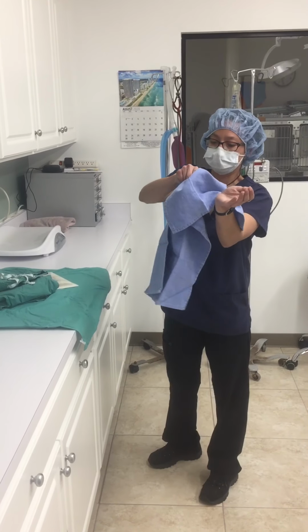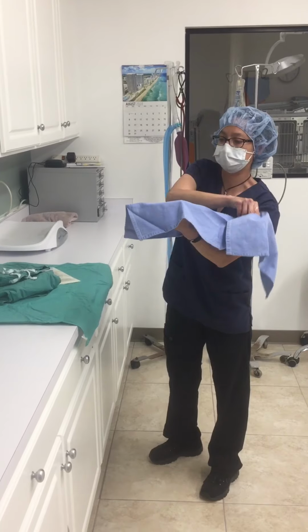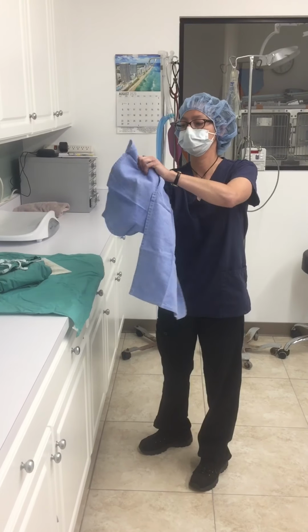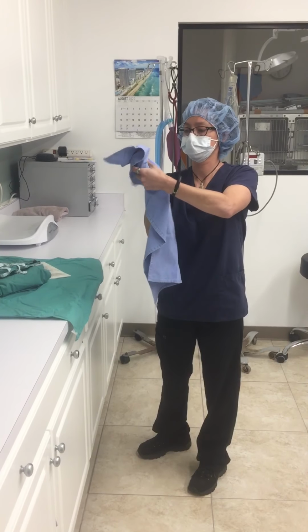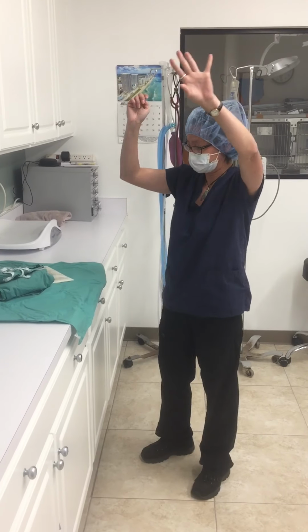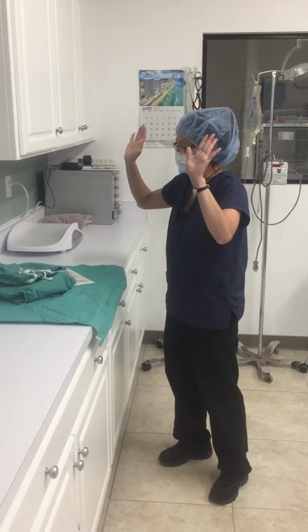Then we're going to reverse. We're going to take this side of the towel and place it on this hand, and do the same thing. We're going to dry each finger and down the arms, and then throw that aside because that is now contaminated. So now we are ready for our gown.